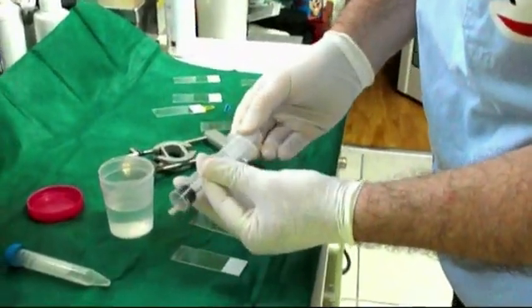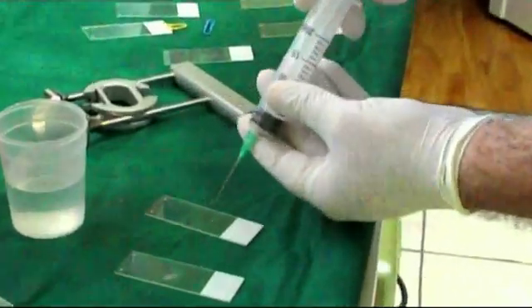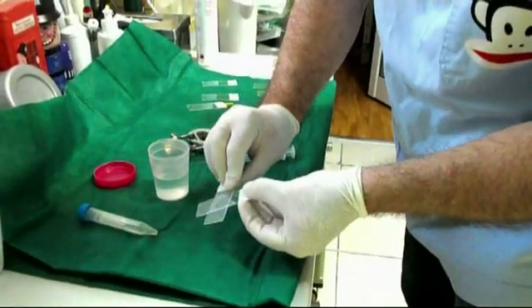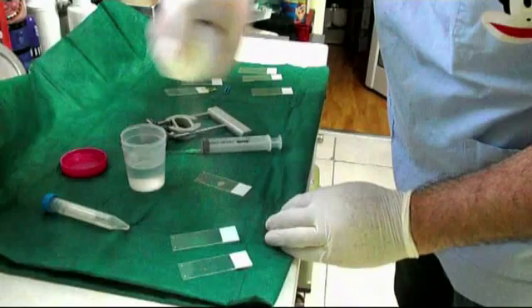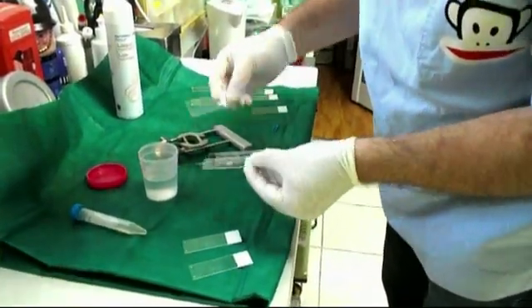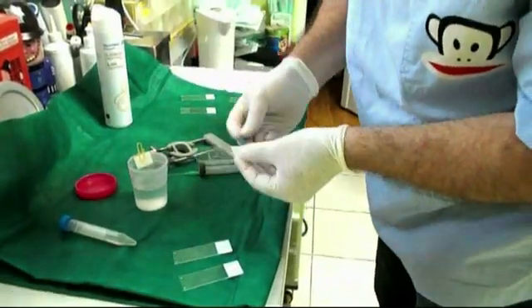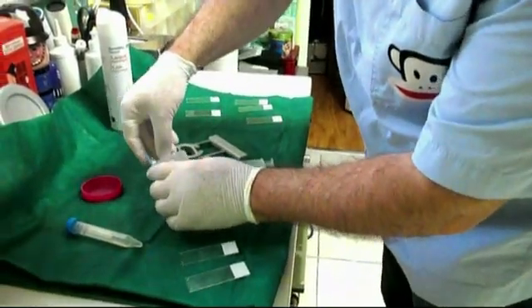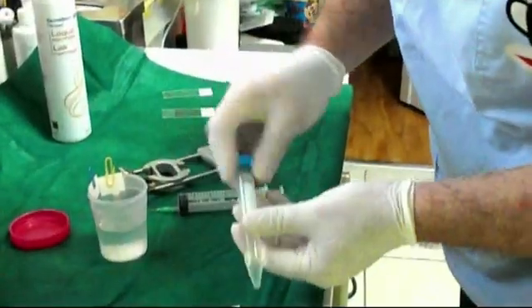Then we disconnect the syringe and aspirate some air, and then we connect the needle again and express the material onto glass slides. A second slide is used to smear the aspirated material and then fixate it according to our cytologist's suggestion. We use fixation spray and then a small amount of cytolite for thin prep fixation. If we think the smear is inadequate, we can repeat the procedure.